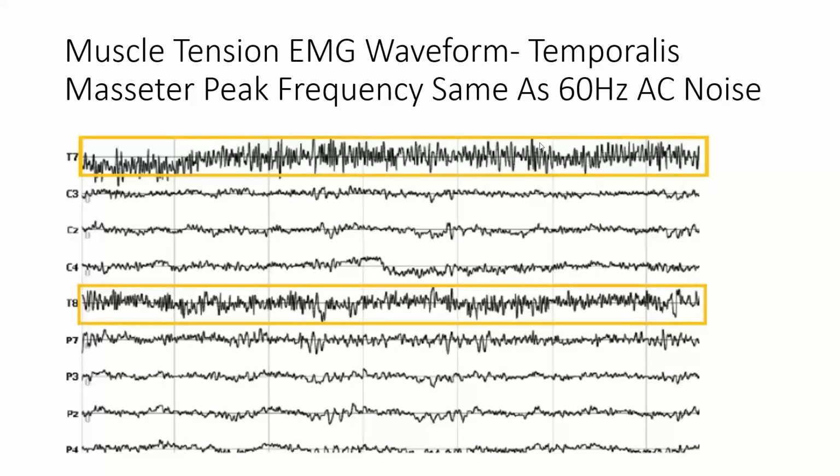And this is AC noise. Now, if you're using EMG equipment like with Thought Technology, really high-end biofeedback equipment, they rectify it. They take it from being a sine wave up and down, and they turn it into more of a DC wave. And there's a way you can do that with diodes and rectification methods. And we don't need to get into that. And you often measure it as root mean square instead of peak to peak, like with EEG. We don't need to get into that.